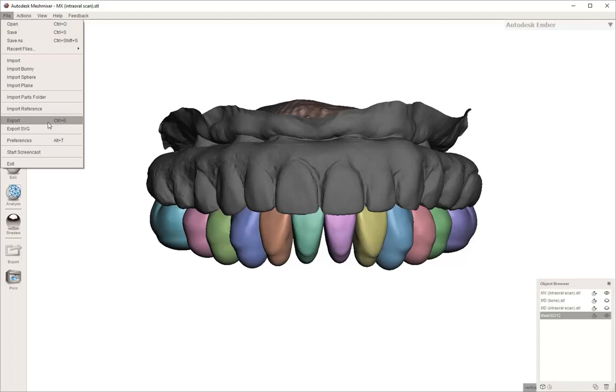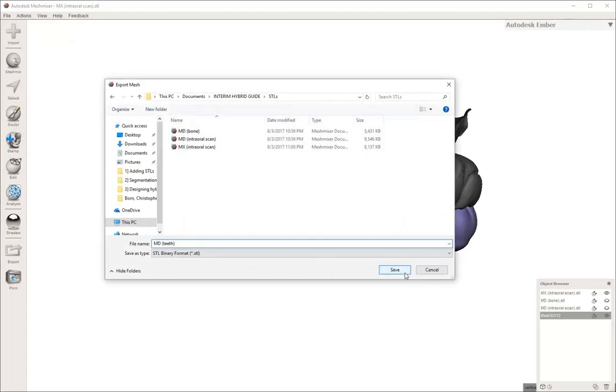They are still connected because we never actually separated them. So we can go in and export these right here. We're just going to name them MD and in parentheses teeth.